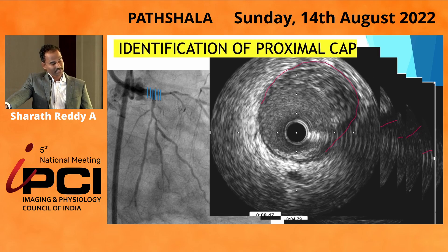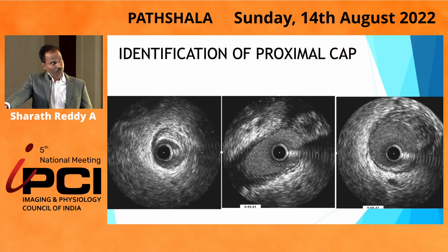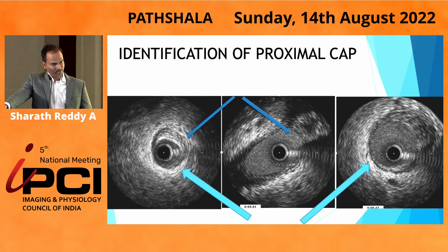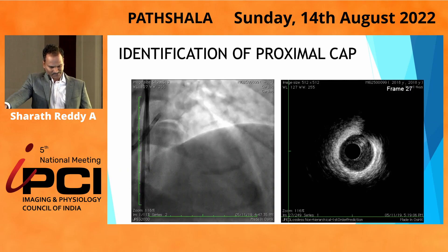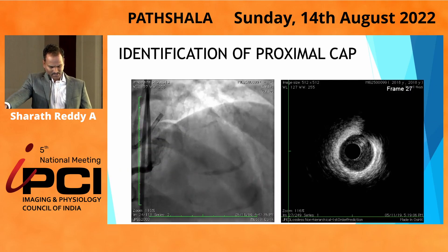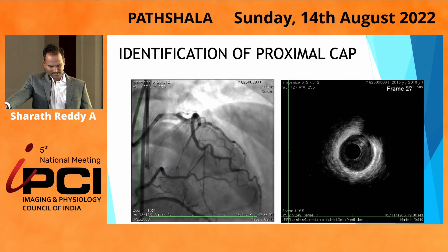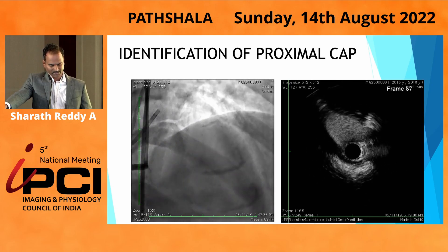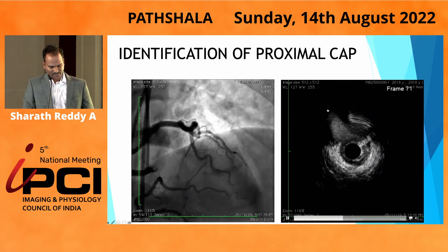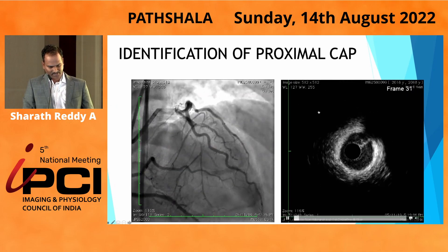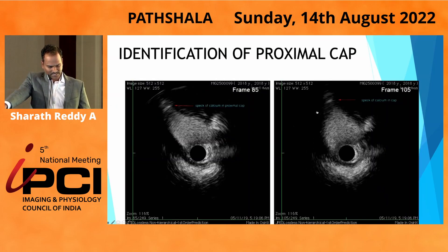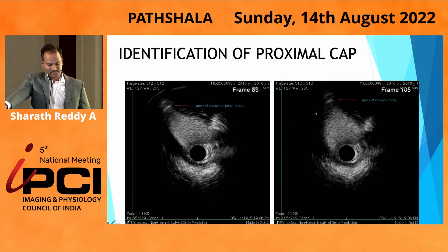You can see the sudden jump in vessel size. Two things help you identify the proximal cap: one is the absence of media in the zone, and the second is the sudden jump in vessel size, which tells you where the ostium is. On IVUS, there is a clear entry point, and you can also see a fibrocalcific speck sitting there, which also dictates which wire you will choose.